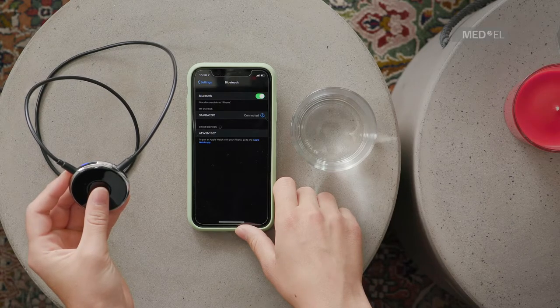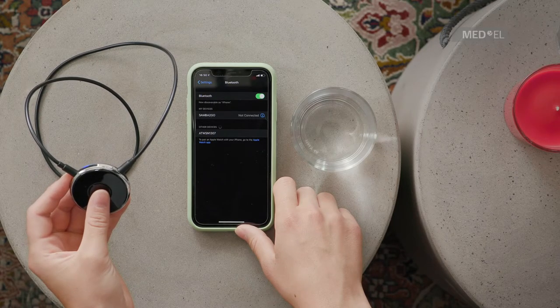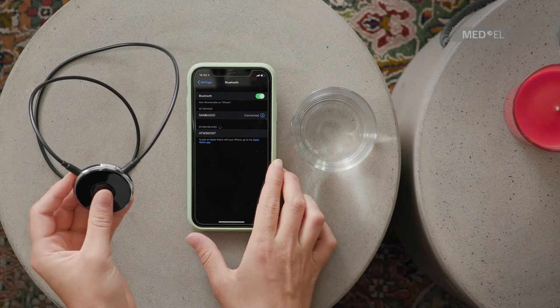Pairing is complete when the blue LED stops flashing, is illuminated for five seconds, and then is no longer illuminated.